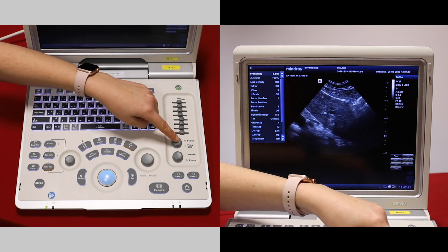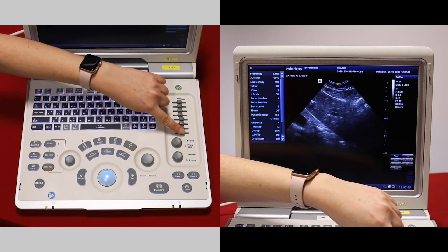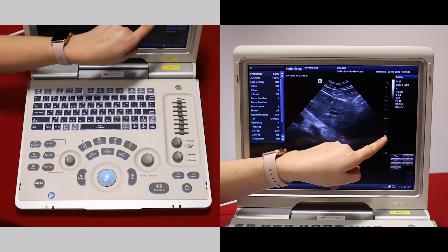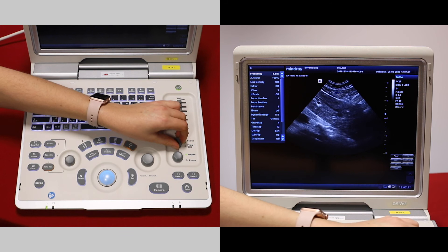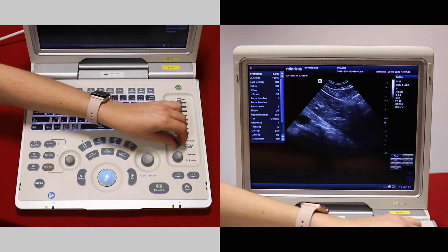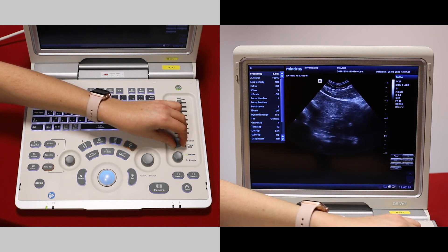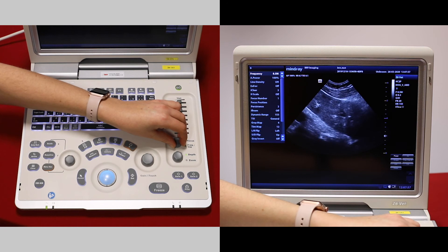To change the focal point, press this button so that focus is highlighted and our focal point is shown here on the screen. Twiddle this now to change your focal position. I like to put my focal point just deep to the organ of interest.